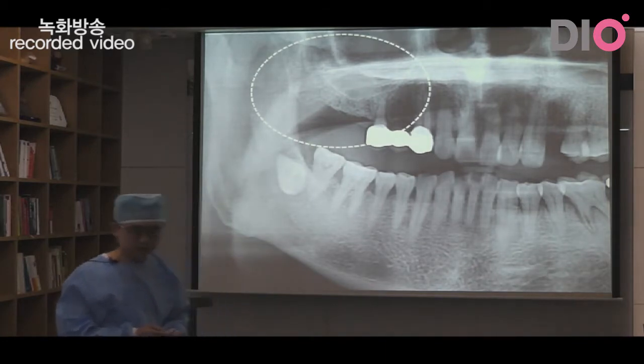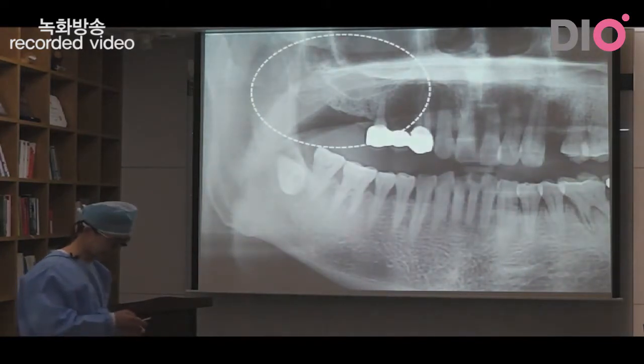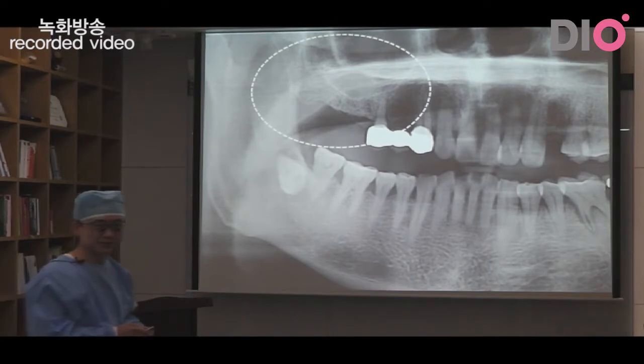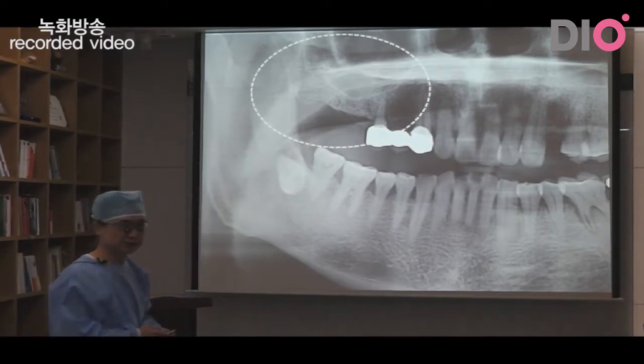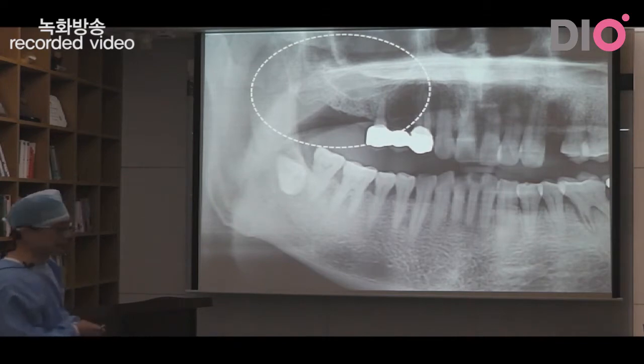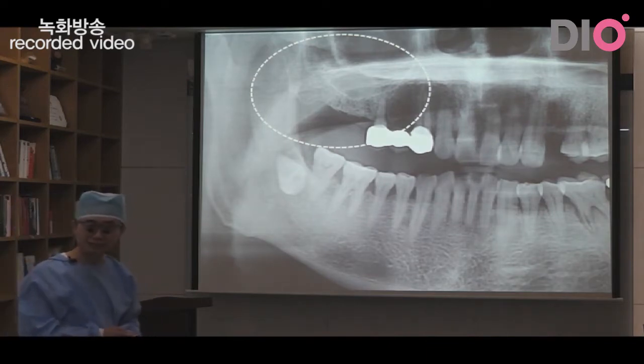Let me show you the patient. You can see here the patient x-ray. The patient is 63 years old. You can see the missing teeth in the upper right molar area. I'm going to place two implants in the area.